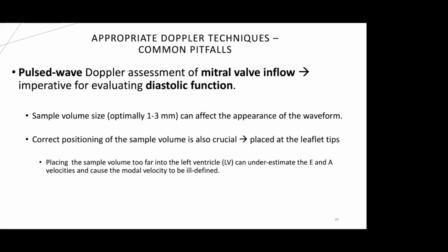I think the other trick that we have to remember here is this is a Doppler assessment. So you need to put your color box on and look at the direction of flow, because if you just take your non-optimized 4-chamber view, as you know, flow normally goes out to the lateral wall, comes around the apex, and then gets ejected out. So if we don't optimize for that, you're going to get about 25 degrees off the Doppler, which will mean you're going to underestimate the velocities by about 25%. And so unfortunately, you do need to then, as you know, go off the standard axis.